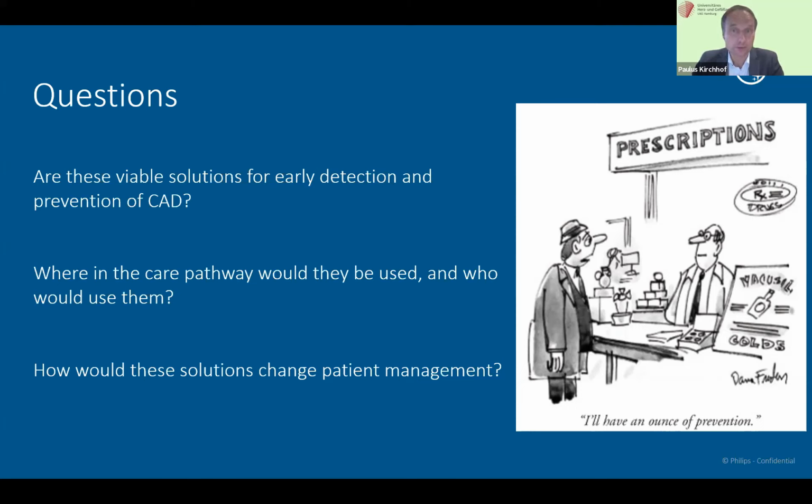And of course, we have cholesterol. And there are good data that very low chronic elevations of troponin or BNP actually predict cardiovascular risk very well. And there are a few emerging blood biomarkers that will probably be ready for clinical use in a few years' time. And I wondered whether you have compared your ultrasound point of care prediction with any of these approaches, which are probably, if they have the same precision, easier implemented at scale than handing out point of care ultrasound devices. Yeah, understood. The short answer is no, we haven't done that comparison, but it's a completely valid point.